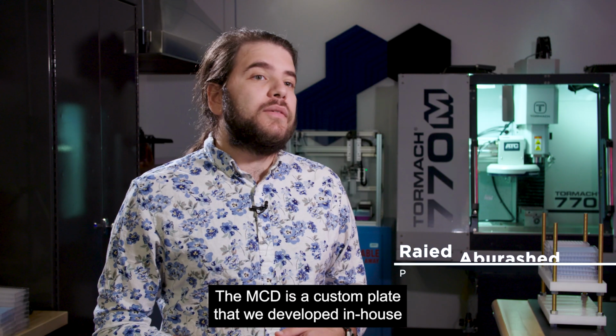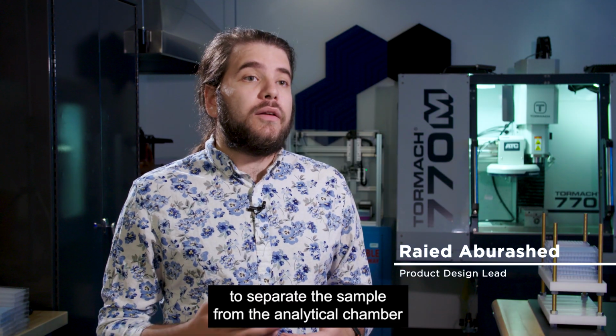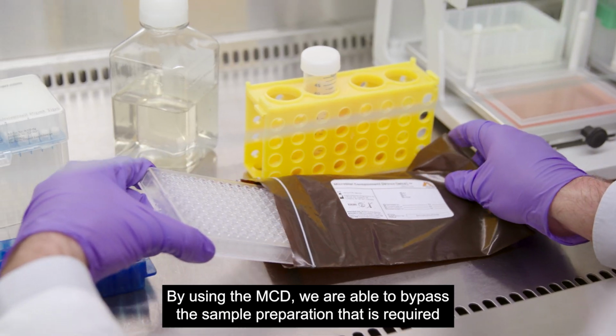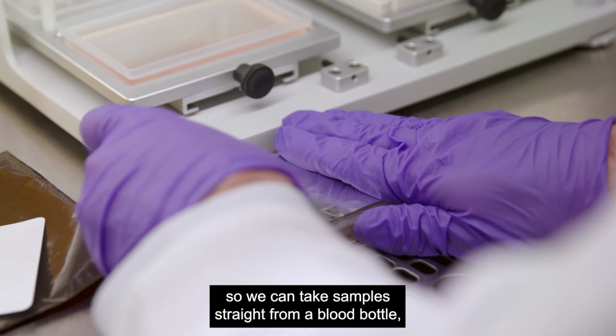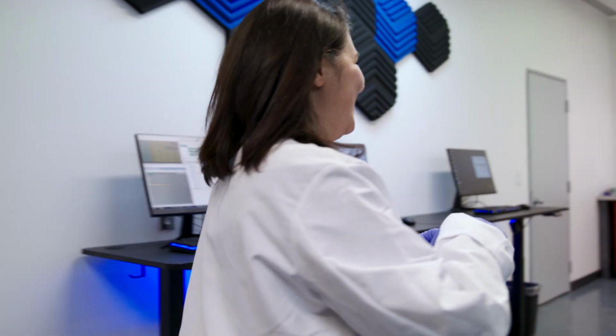The MCD is a custom plate that we developed in-house to separate the sample from the analytical chamber to allow us to real-time sample off the mass spec. By using the MCD, we are able to bypass the sample preparation that is required for processing blood bottles. So we can take samples straight from a blood bottle, put it into our system, and get results directly.